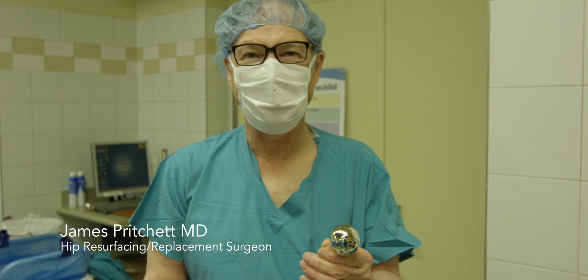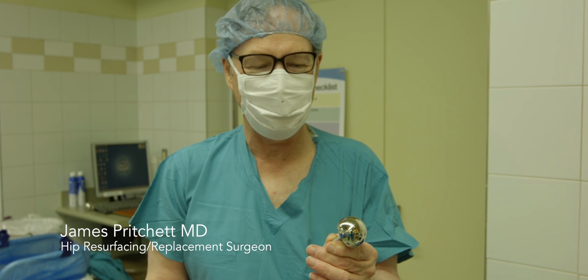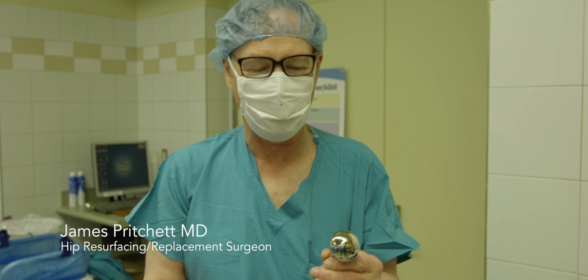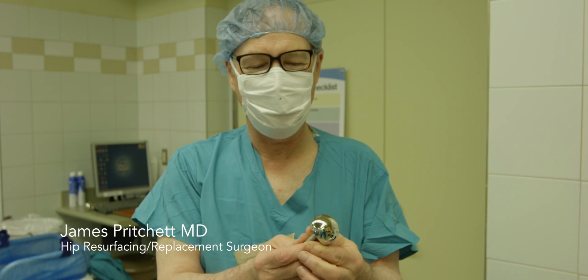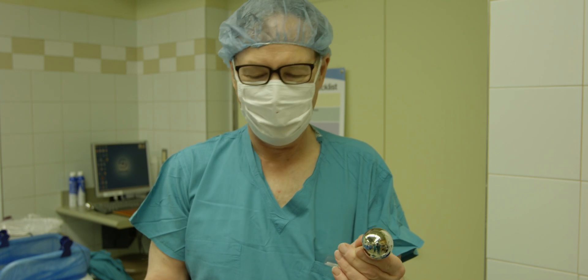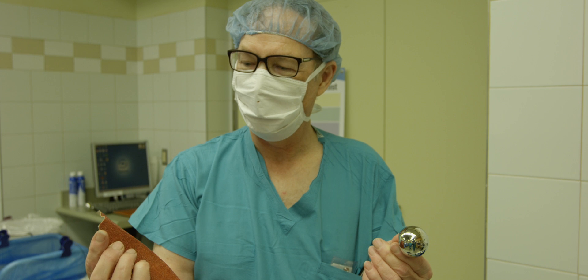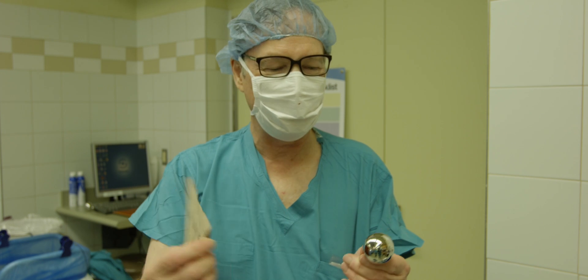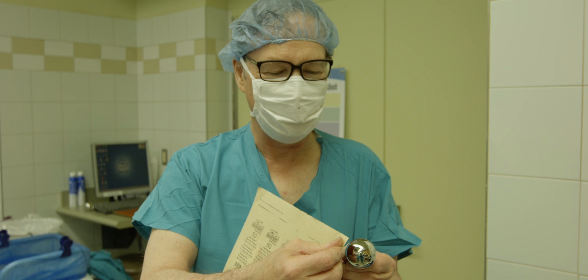We're just going to show some hip implants. This is a Birmingham hip resurfacing, standard cobalt chromium — commonly used and never been in a patient before, brand new. I just have a piece of regular old sandpaper that anyone might have around their home, and we're just going to do a little abrasion testing of the implant.